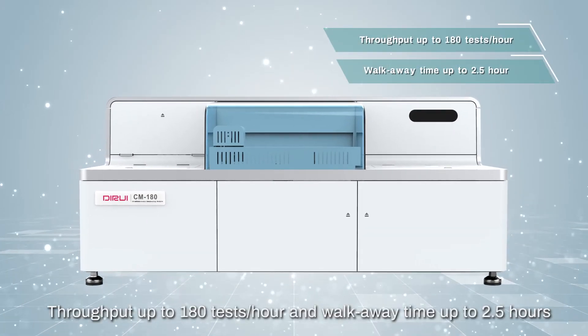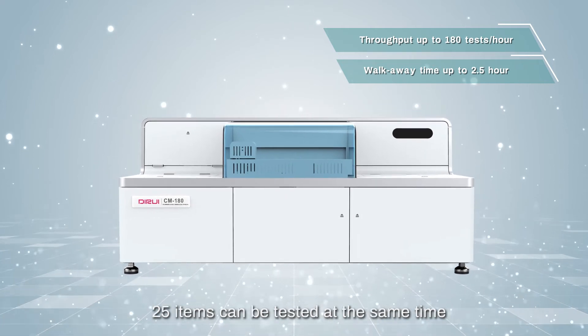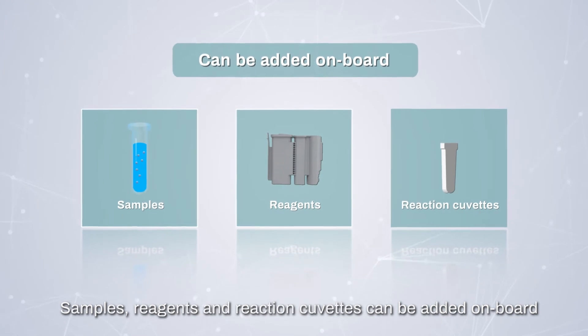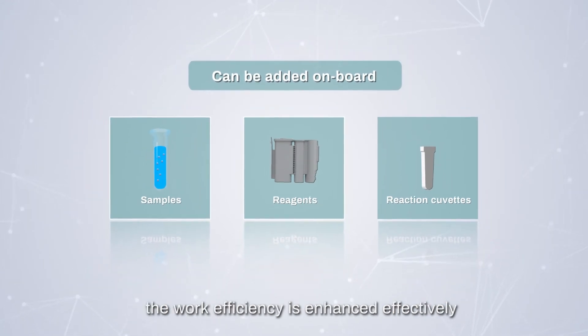Throughput of up to 180 tests per hour and a walk-away time of up to two and a half hours means 25 items can be tested at the same time, fully meeting the needs of laboratory routine and batch testing. Samples, reagents, and reaction cuvets can be added on board, effectively enhancing work efficiency.